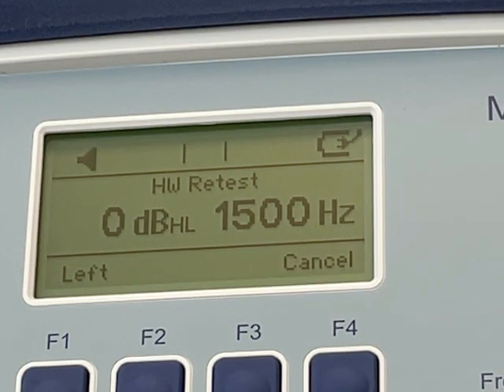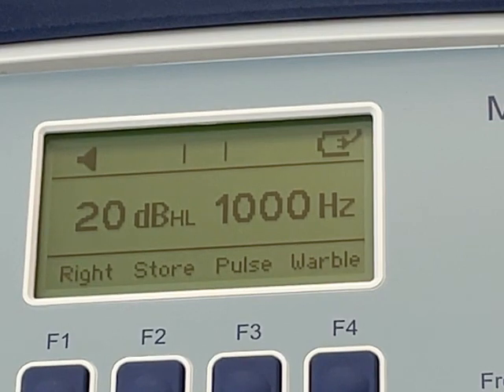When it is done, the display will briefly show "HW test done," and then will return to 20 dB HL 1000 Hz.